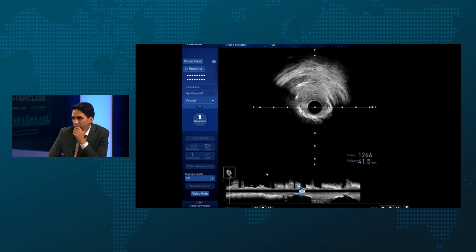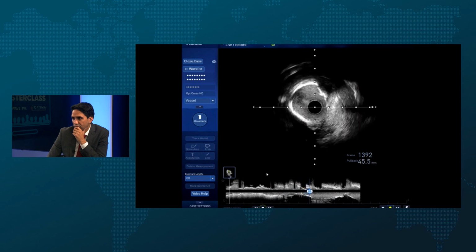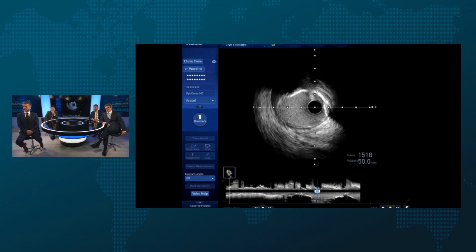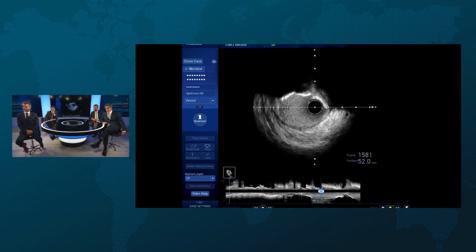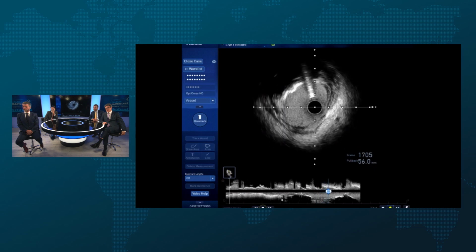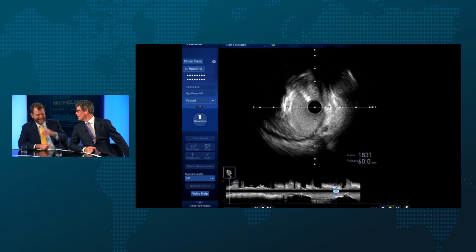So you see a lot more movement in the calcified plaque. See that there? Almost floating. Really nice. Great. So they really see it all: we see fractures, nodular, eccentric, concentric. I mean, this case is really just a master class. Pardon the pun.